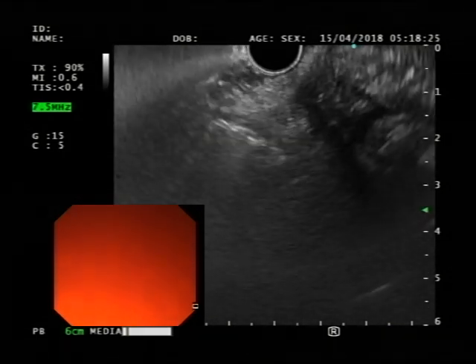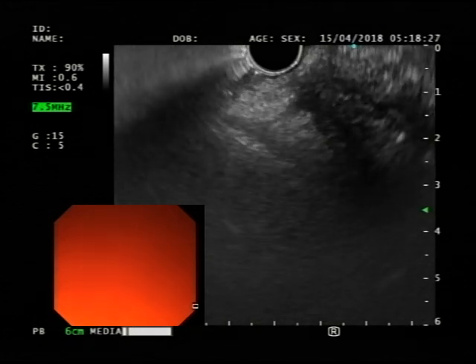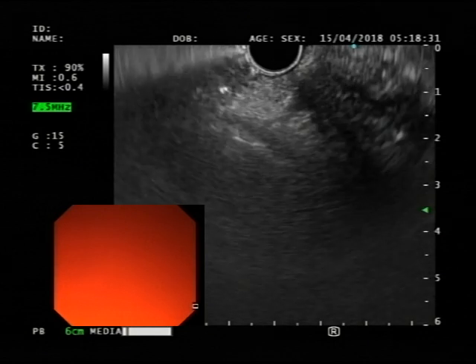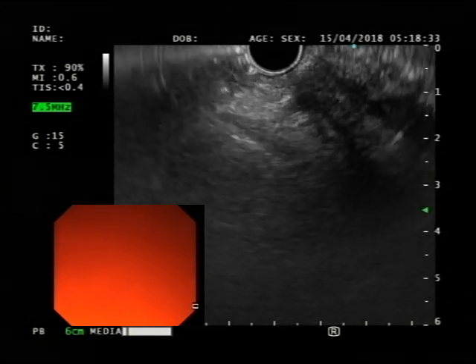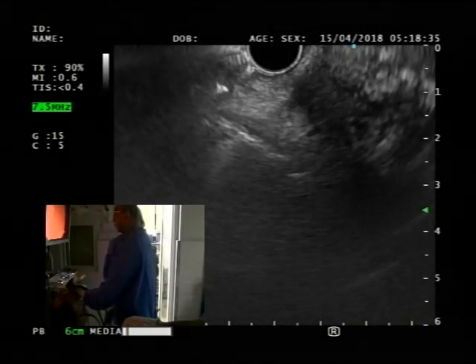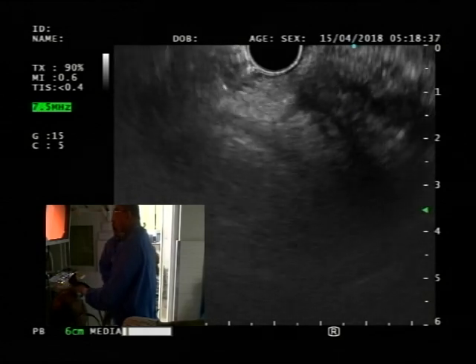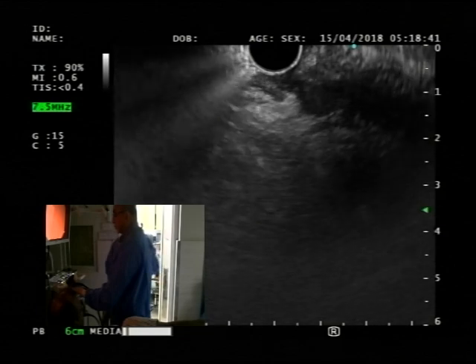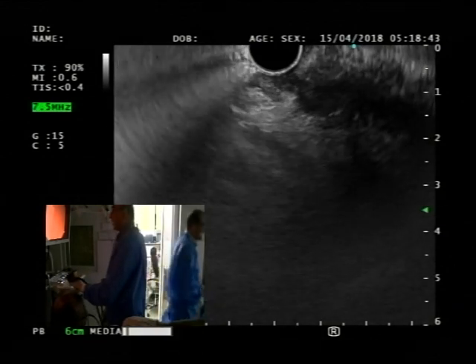So thumb down. And I'm actually going to lock it here, okay? We say don't lock it, but right now it's locked to stabilize you. So I assume that I need to go look at the slide to figure out what we got. Stay there. Right, I'll be back. Okay.